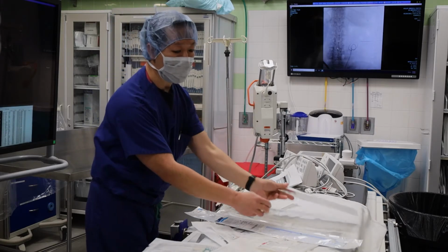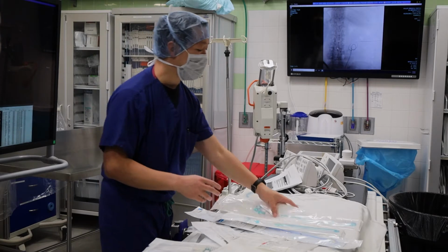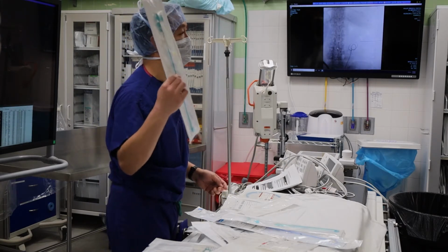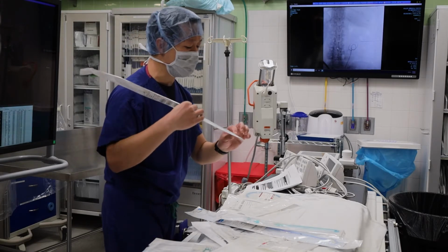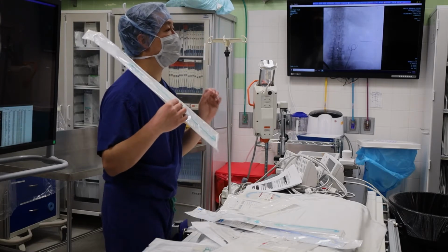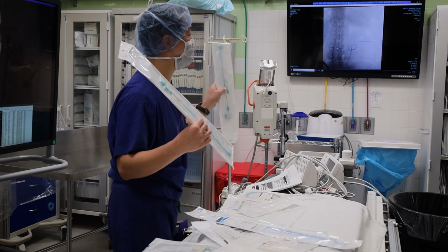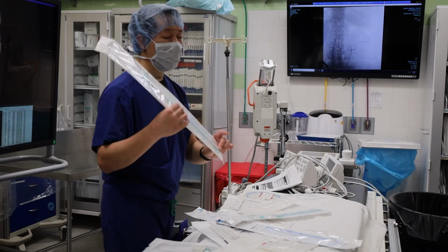So when you start out, because it's atraumatic, you could have still hit an artery and not know. We start by putting in the least traumatic thing, 8 French percutaneous nephrostomy tube. The holes are in a slightly different location. The holes, depending on the brand, are actually cut in a different shape than these to allow different drainage. Okay. Somebody gets an 8.